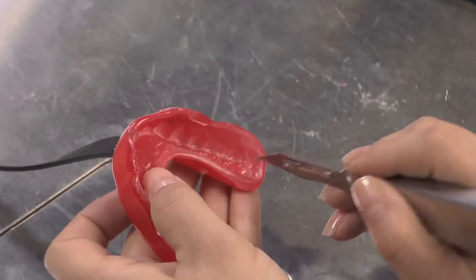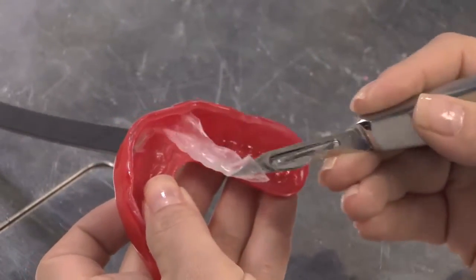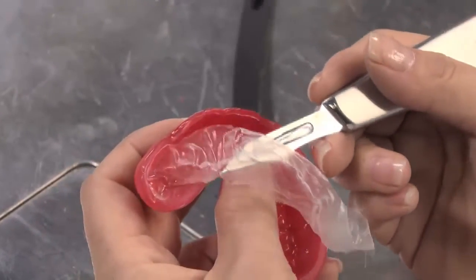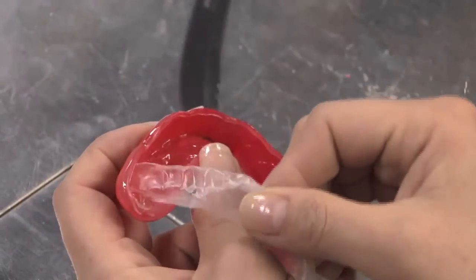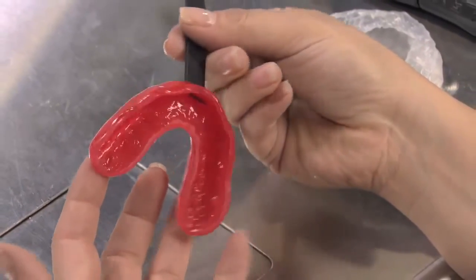Finally, use a knife to gently remove the isolating foil from inside the appliance. The PlaySafe Triple is now ready for use.